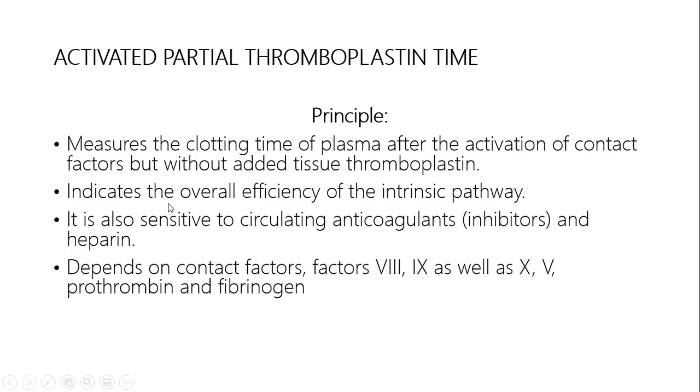Now, APTT indicates the overall efficiency of the intrinsic pathway. So as opposed to the PT, which assesses the extrinsic coagulation pathway, the APTT is used to assess the intrinsic coagulation pathway of the patient.